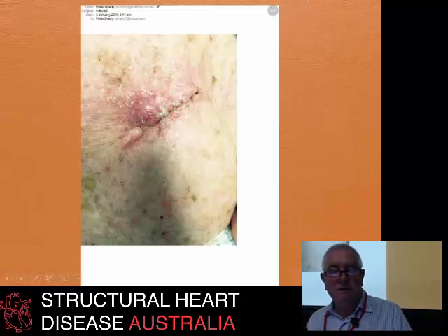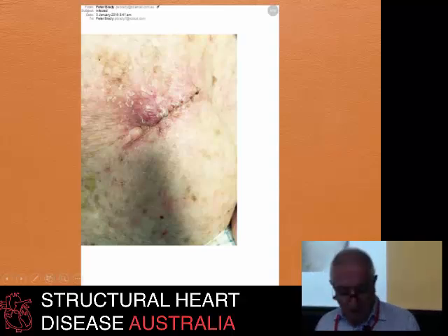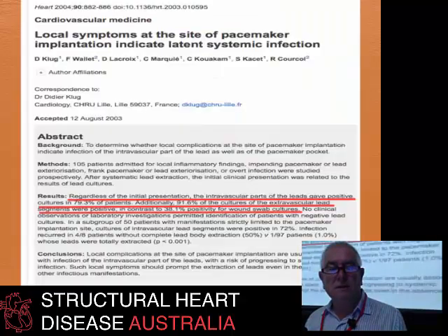What do we do about this? This is a patient that came to see me, with a device implanted somewhere else, several years earlier, and this is what it looks like. Many people would be tempted to just treat this with antibiotics. I think as we're getting smarter and we've got more evidence, we know that's not the right thing to do.